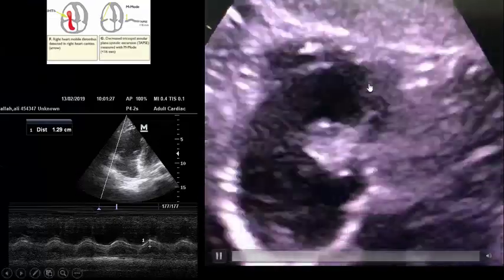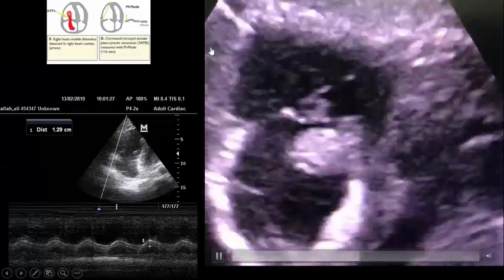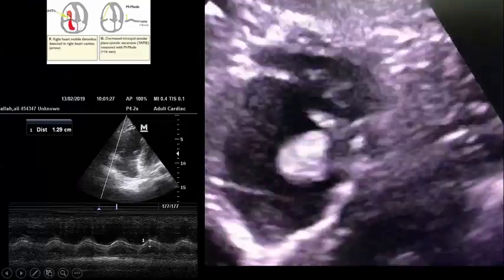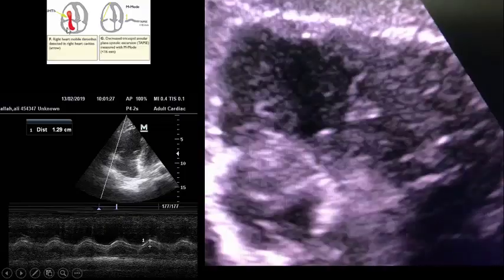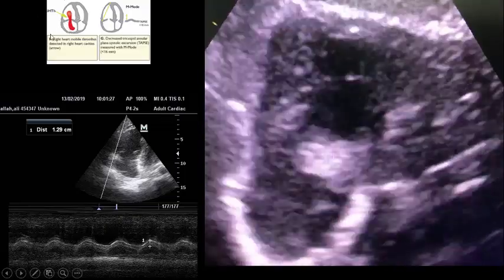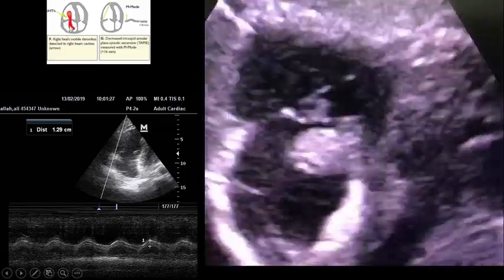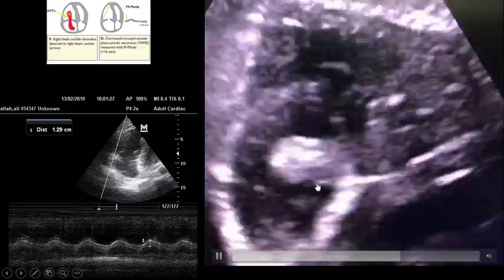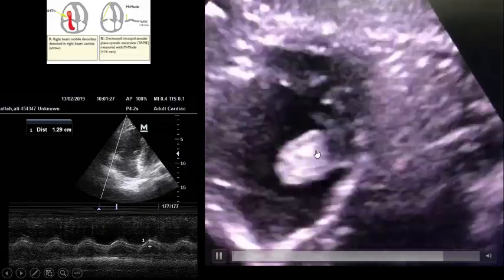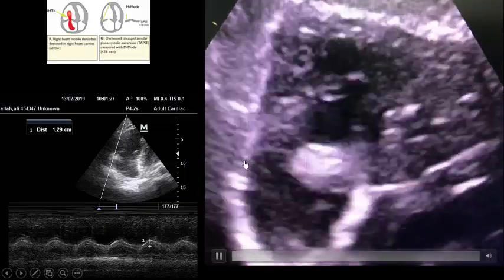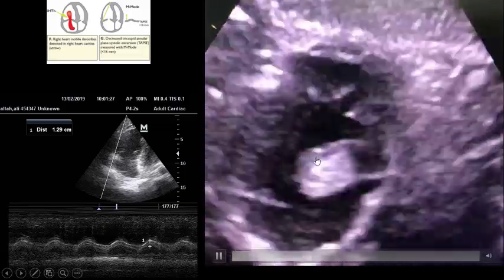Another sign is direct thrombus visualization, which is the gold standard way to diagnose embolism. As you see here, you can see a thrombus in the right atrium of this patient — this is the most specific echocardiographic finding.